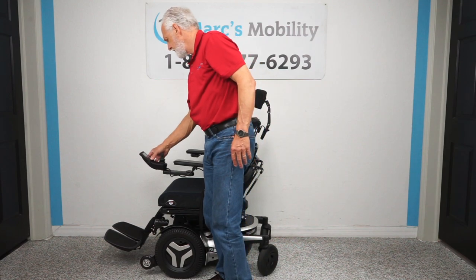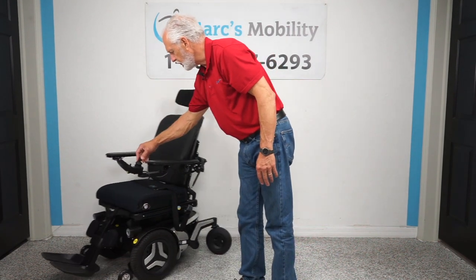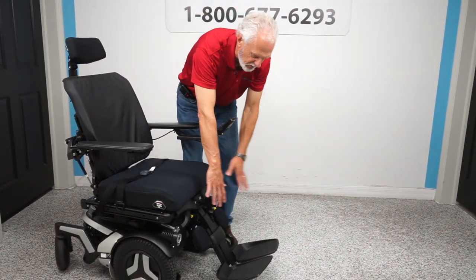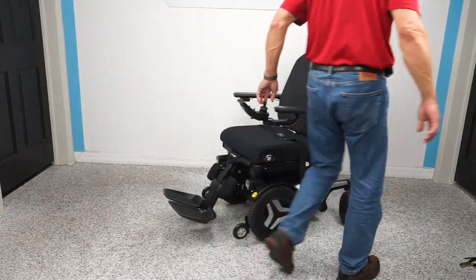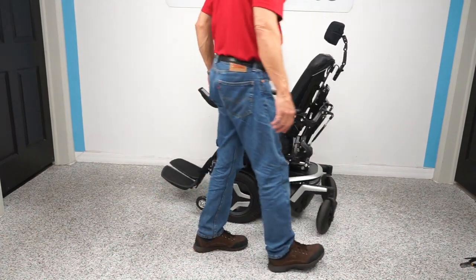Now we're going to put the chair in drive, and I want to show you how this chair turns in a circle. If you have it in your house, you'd want the legs all the way in. The more they're out, the more room it takes. Watch how it turns — you can see it turns pretty much on its own axis.